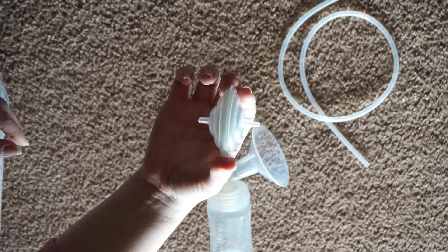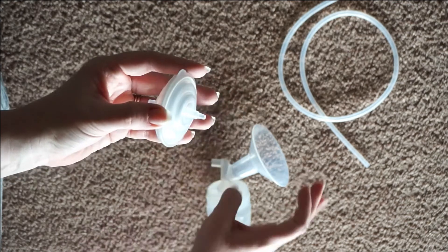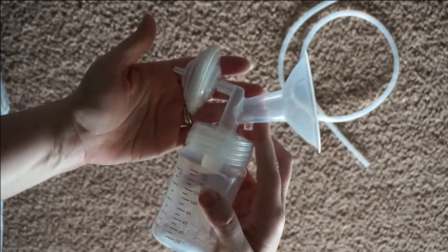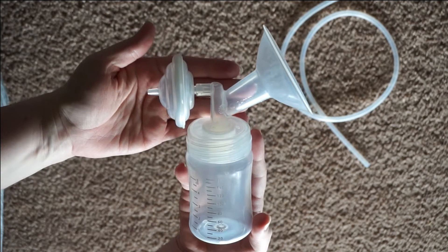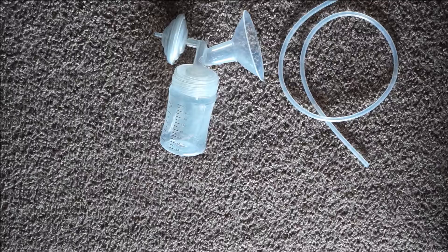As far as which side you put in, you're going to want to put this side inside the connector itself. I like to give a twisting motion so as not to be too harsh on the connection and avoid breaking anything off. And then this backside will go into the tubing.